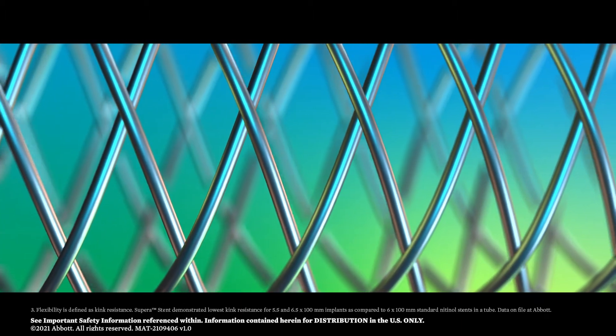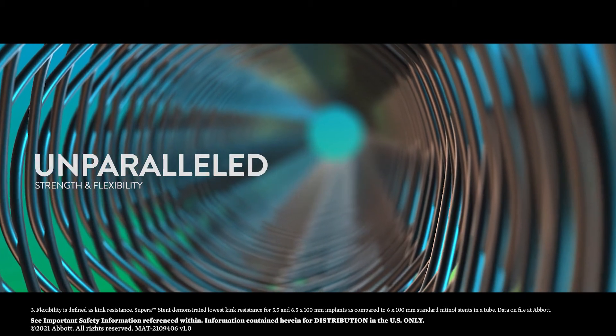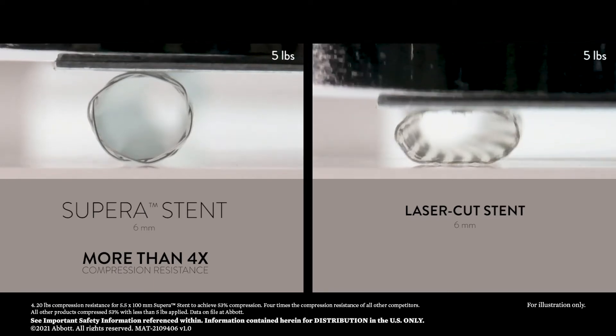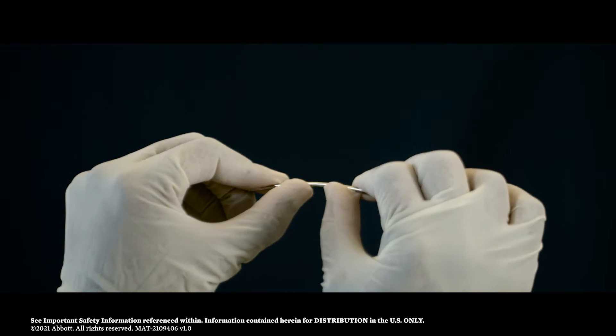The stent's design results in unparalleled strength and flexibility, with more than four times the compression resistance of all other standard self-expanding nitinol stents, which are laser cut from a rigid, inflexible nitinol tube.